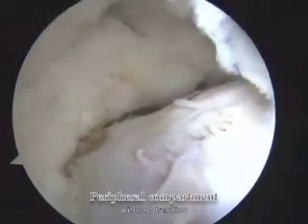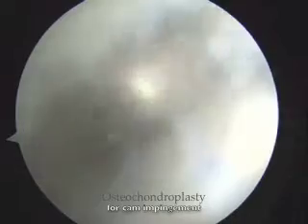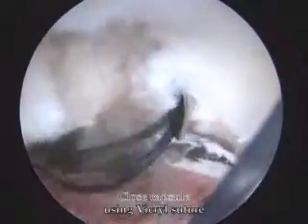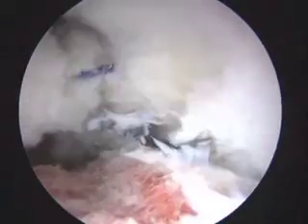We performed the femoral osteoplasty using motorized round burrs. Capsular plication is done through the mid-anterior portal with the hip placed at 14 degrees of flexion.